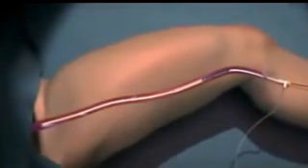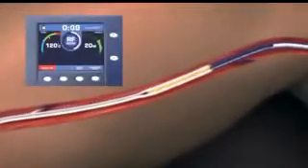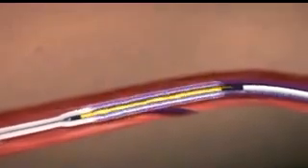Fully compatible with existing Venus RFG Plus generators after a software upgrade, the Closure Fast Catheter monitors treatment parameters in real time and delivers optimal therapeutic power through the system's controlled feedback mechanism.